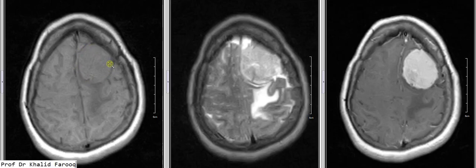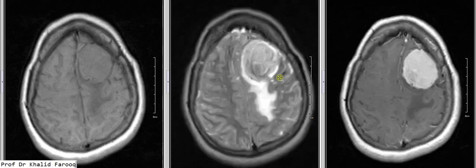We can see there is a solid mass lesion on all these sequences which shows intense homogenous post-contrast enhancement. On axial T2-weighted sequence, we can see a CSF sleeve between the mass and the brain parenchyma, which can be noted on axial T1-weighted sequence as a low signal intensity area, and here we have a high signal intensity area favoring CSF sleeve.